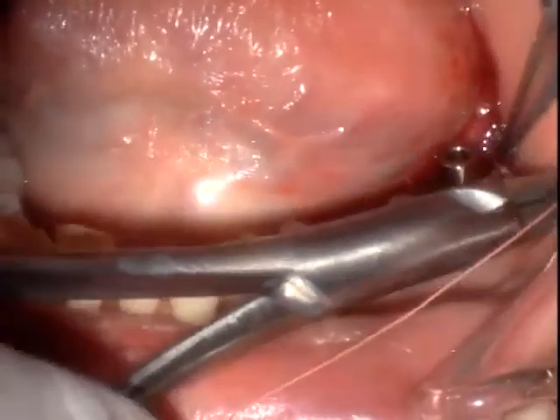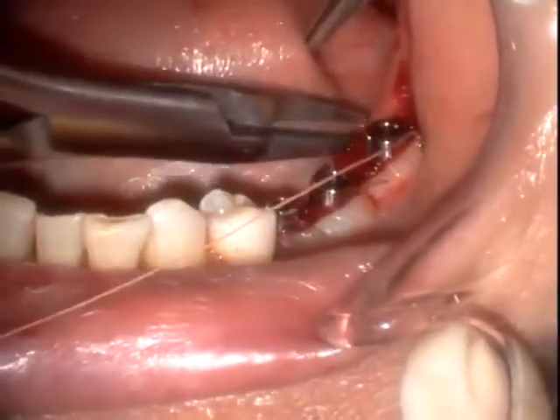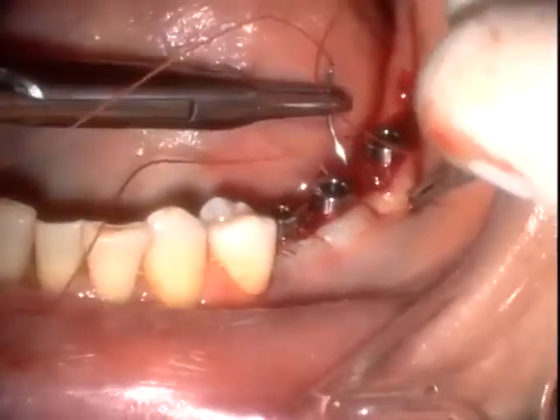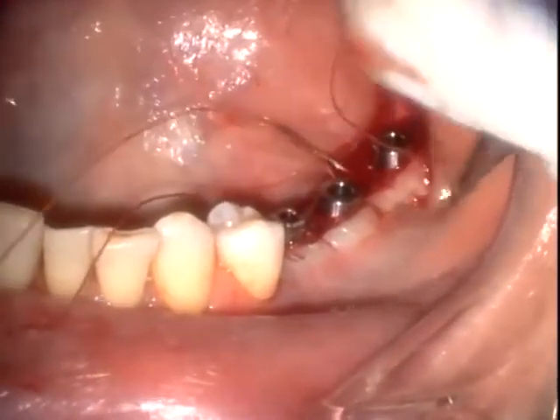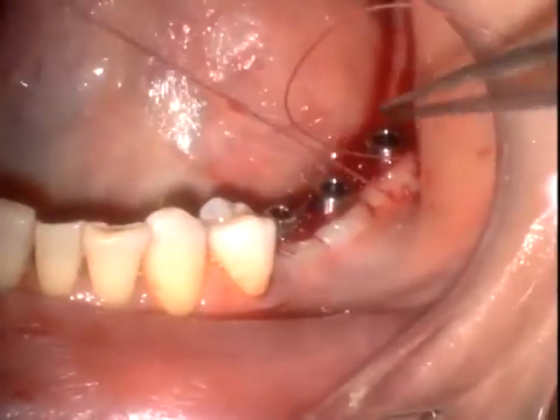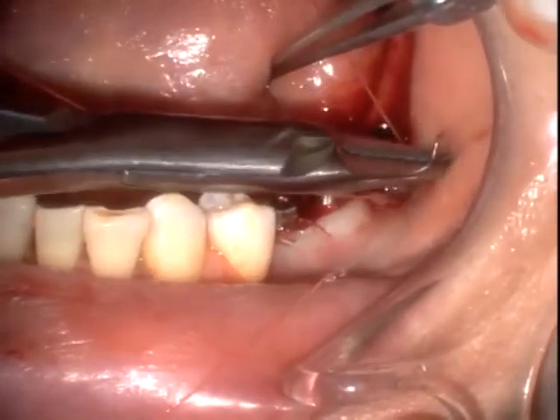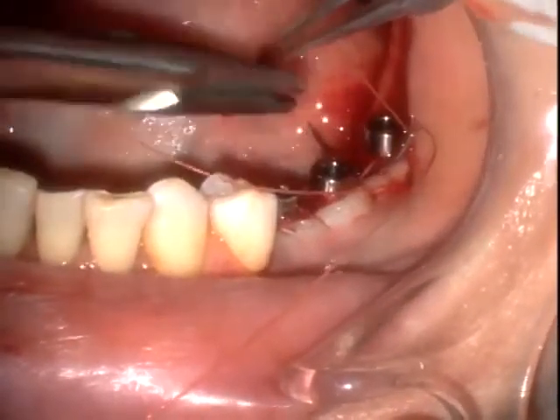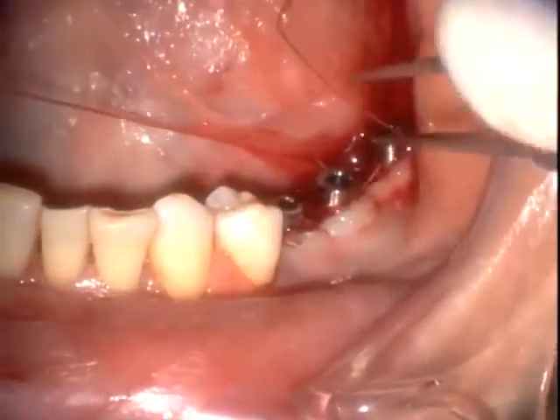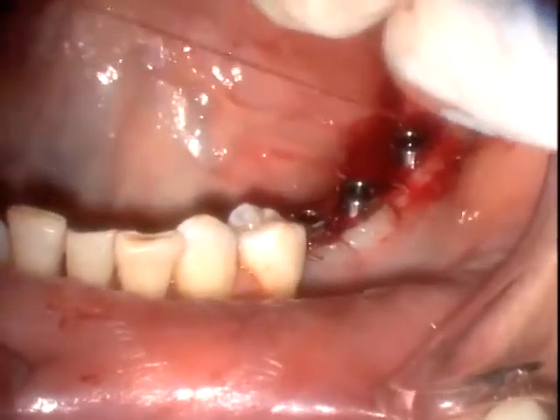We've been able to keep a band of 2 millimeters of keratinized tissue towards the buccal aspect, which to me is an absolute must. If I don't have at least 2 millimeters on each side of the future implant abutments, then my suggestion would either be to do a preliminary soft tissue augmentation procedure prior to implant placement, or it can be done at second stage uncovering of the implant utilizing free gingival graft and a vestibuloplasty type of surgical procedure.